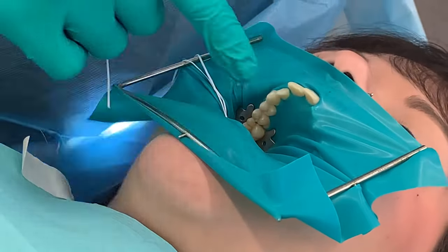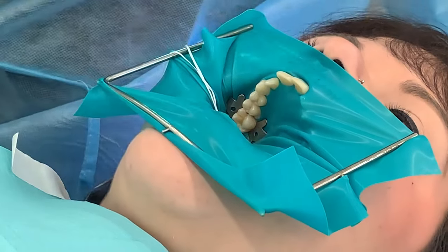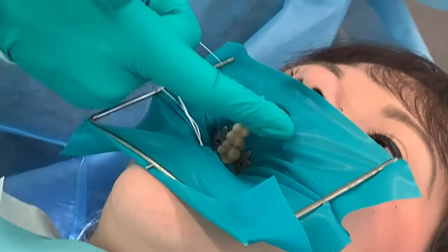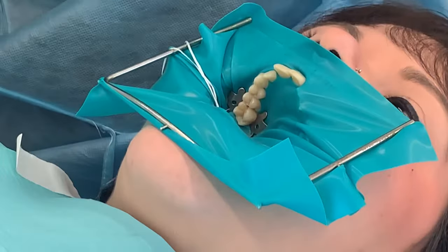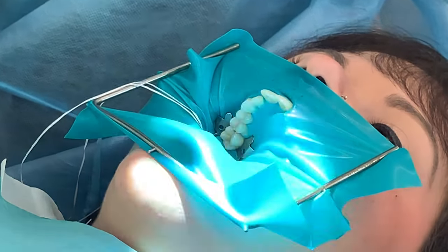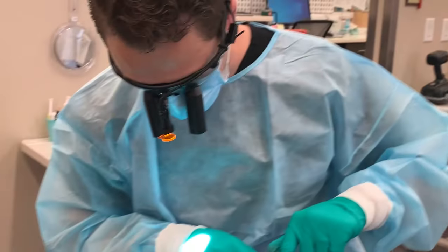I did a couple of extra teeth since I want you to be able to see it easier — normally you don't have to go quite this far. Also, if I don't need a widget or a piece to put in between the last tooth, I don't put it. If it's not popping out, I just leave it like that. I think the importance is being able to do it efficiently and with good quality.